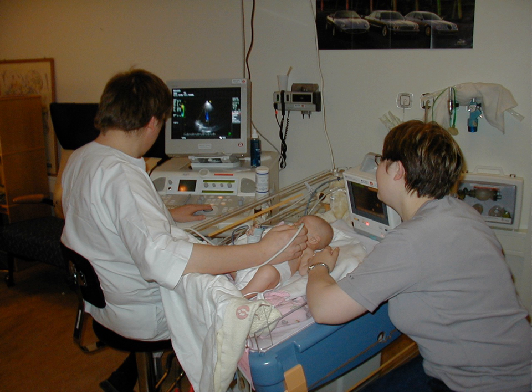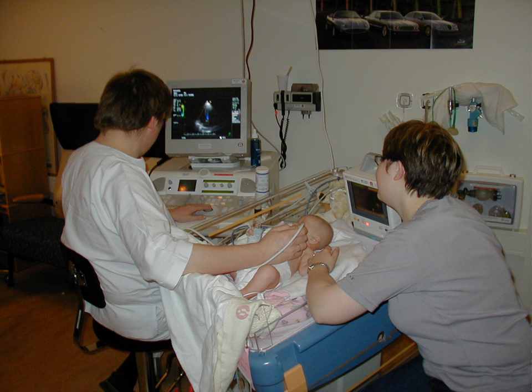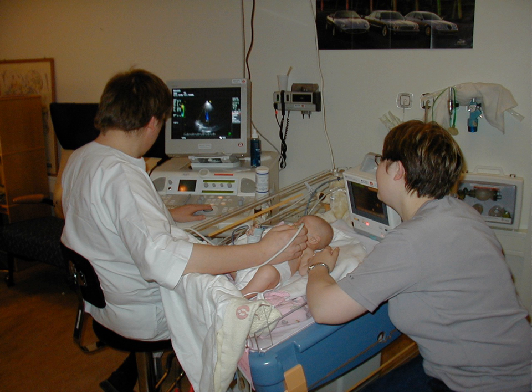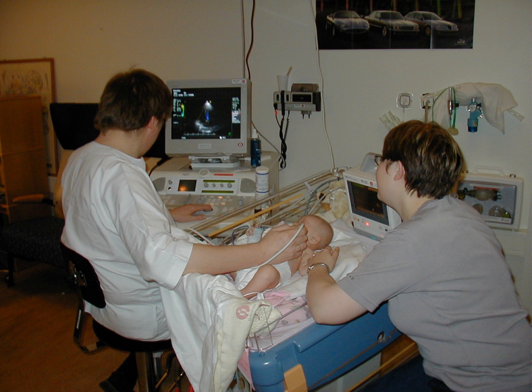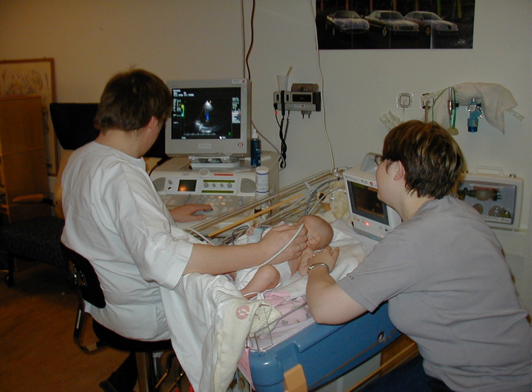Gynecologic ultrasonography examines female pelvic organs — specifically the uterus, ovaries, and fallopian tubes — as well as the bladder, adnexa, and pouch of Douglas. It commonly uses curvilinear and sector transducers, as well as specialty transducers such as endovaginal. Obstetrical sonography was originally developed in the late 1950s and 60s by Sir Ian Donald and is commonly used during pregnancy to check on the development and presentation of the fetus. It can identify many conditions potentially harmful to the mother or baby that might remain undiagnosed in the absence of sonography, and the risk of leaving conditions undiagnosed is believed to be greater than the small risk associated with undergoing an ultrasound scan.